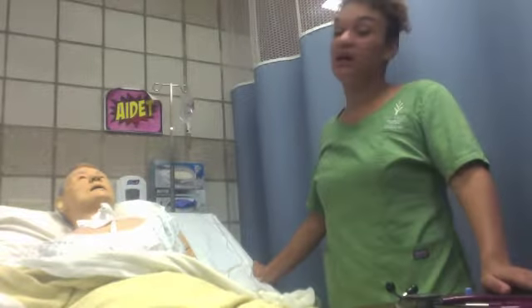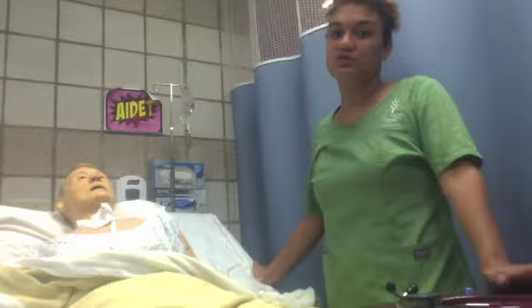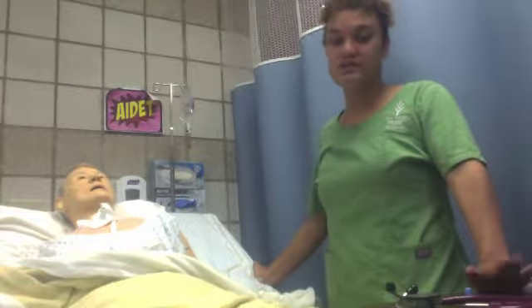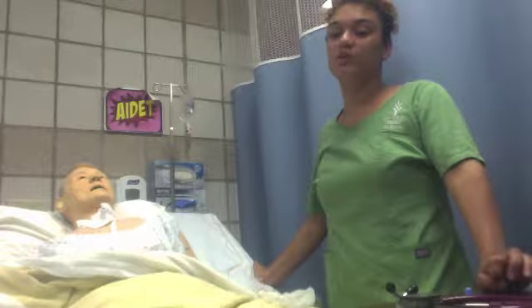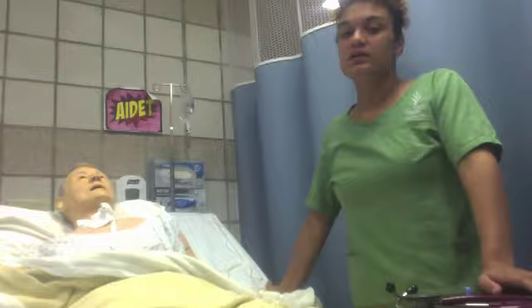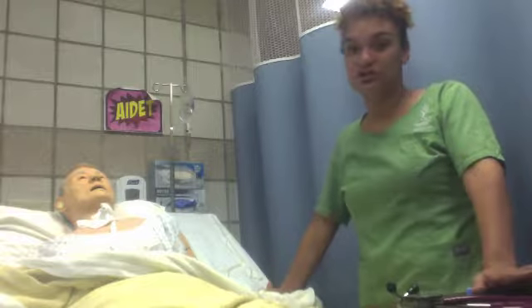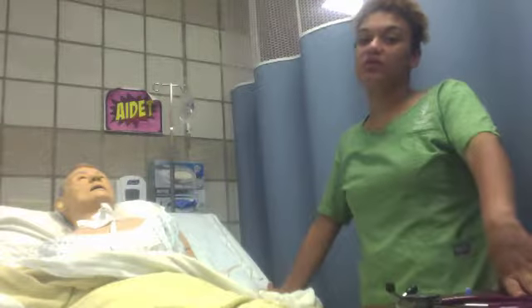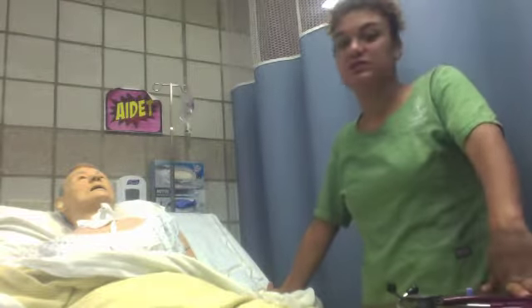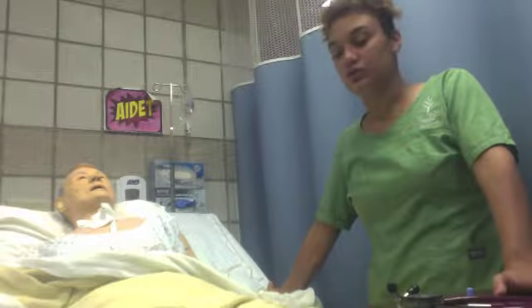I'll be looking at any allergies to the medications, as well as any allergies or reactions to the therapy itself. I will be looking for any previous reactions, how well they have tolerated it, the flow, the findings, the expirations on the medications or the bag that's hanging, and if there was any leaking, color changes, odors, anything that was notable before.